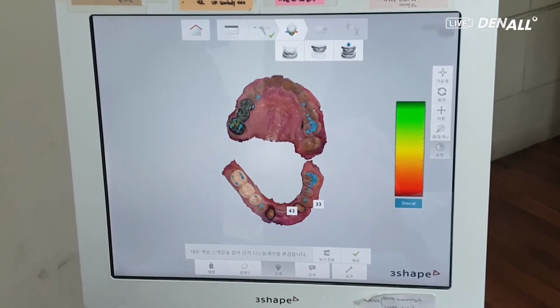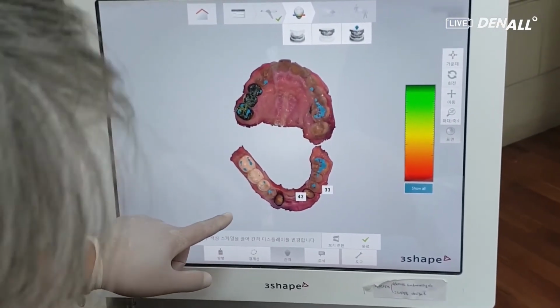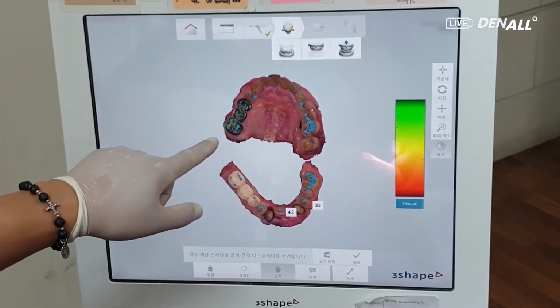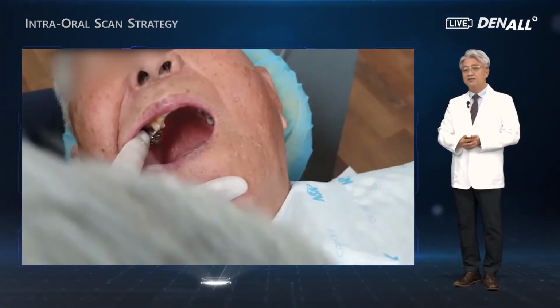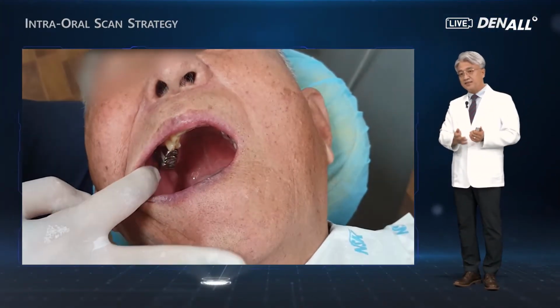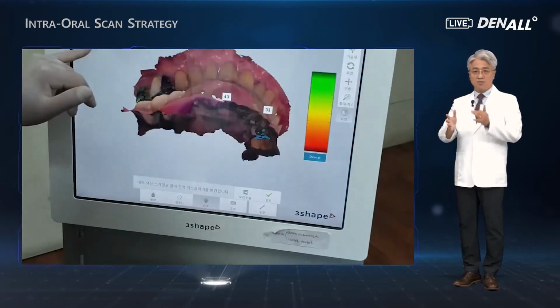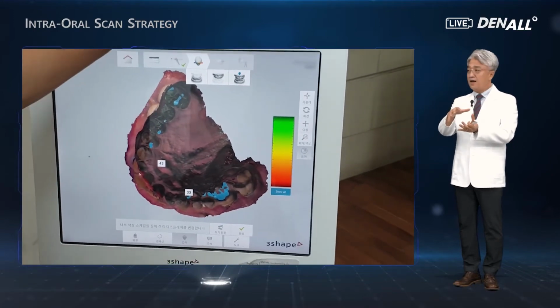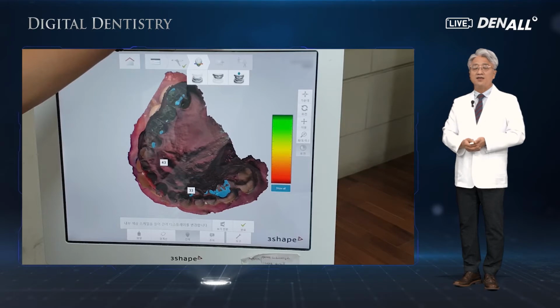Another important advantage of digital is that patients can look at the contact points directly themselves. Before scanning, have an ortho patient bite on an articulation paper. Articulation marks would be obtained and compare them to the ones in the digital model. If they are similar or consistent, the accuracy of a bite vertical dimension or occlusion can be verified one more time.